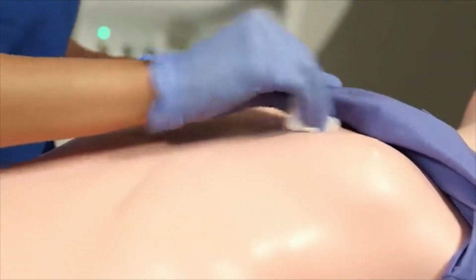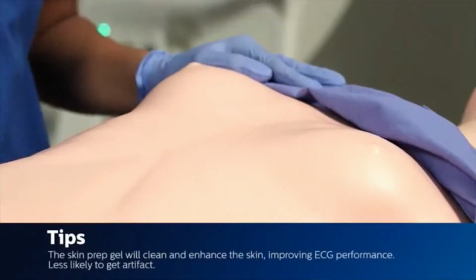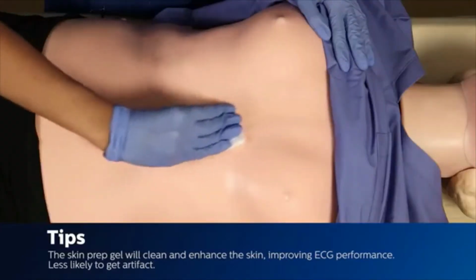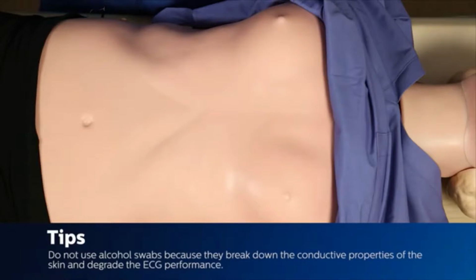Wipe excess after scrubbing. Tips: the skin prep gel will clean and enhance the skin, which will improve the ECG performance. You will be less likely to get artifact. Alcohol swabs break down the conductive properties of the skin and degrade the ECG performance.